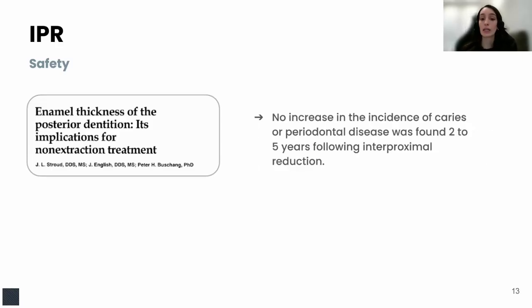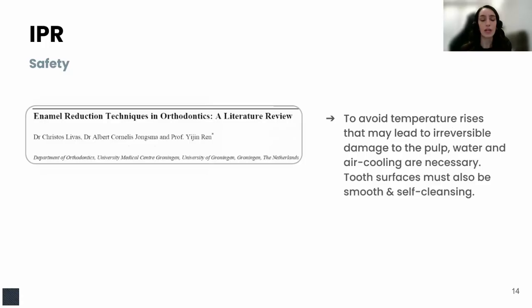And if we want to talk about caries as well, studies have shown that no increase in the incidence of caries or periodontal disease was found 2 to 5 years following interproximal reduction. So again, as long as the patient already has good oral hygiene, and as long as they do not have any existing inflammations, it is safe to perform IPR.